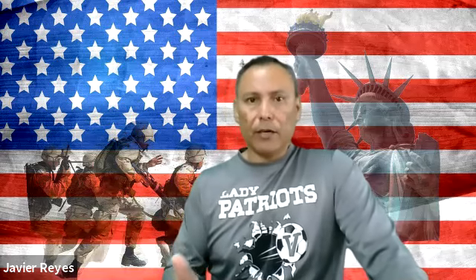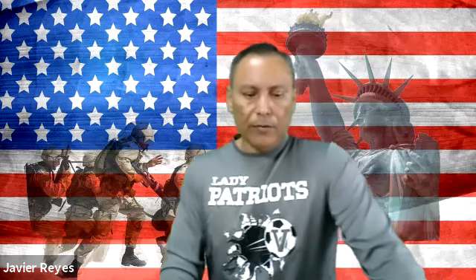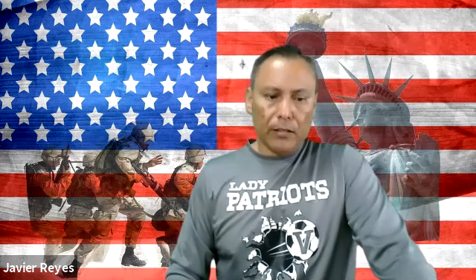And I did mention this the other day, right, when we came here in class. If specimens cannot be transported or analyzed promptly, they can be held at room temperature and protected from bright light up to 2 hours. So you can store it anywhere there, you know, somewhere protected from light. But after that, they have to go in the fridge. So you have to know that, okay? For sure, you're going to see it on the national exam because it's a test that is done very, very commonly, okay?